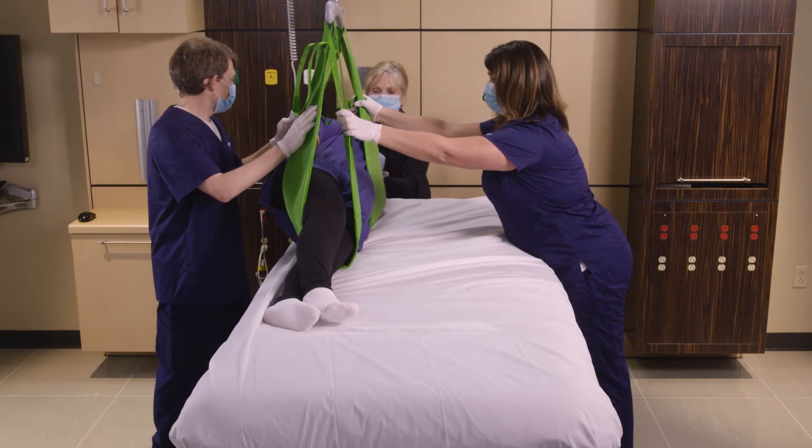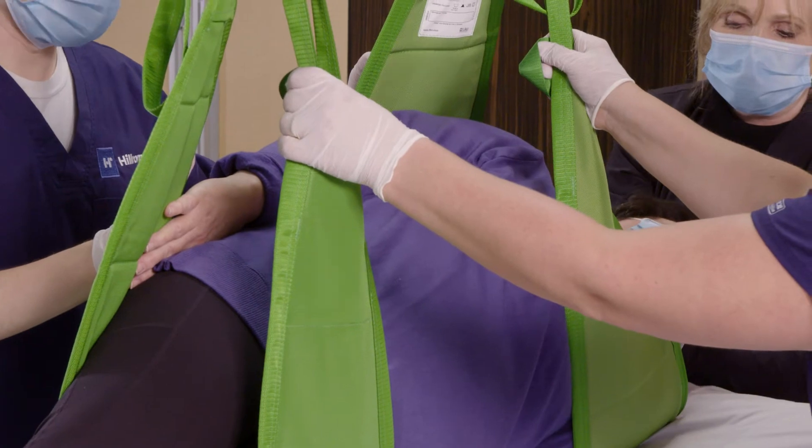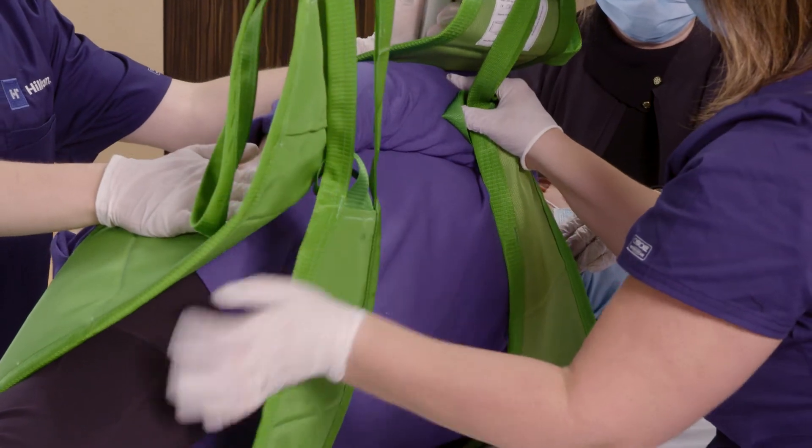Now when we're ready we're going to lower the patient. The nice thing about this method is we can pause at any point to place pillows or positioners and manage the lines and tubes of the patient.